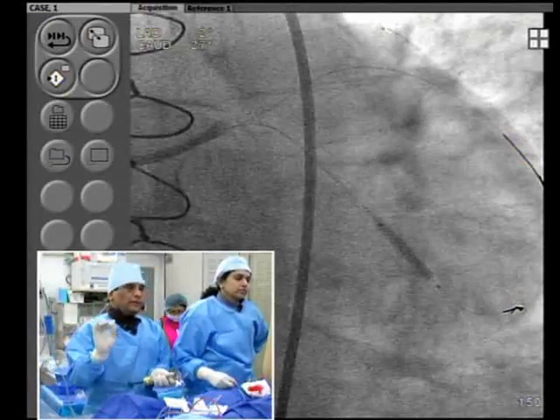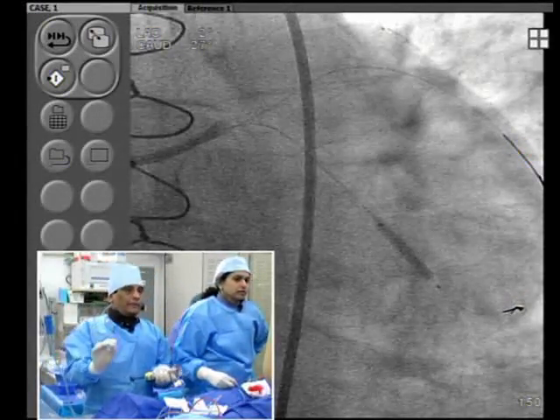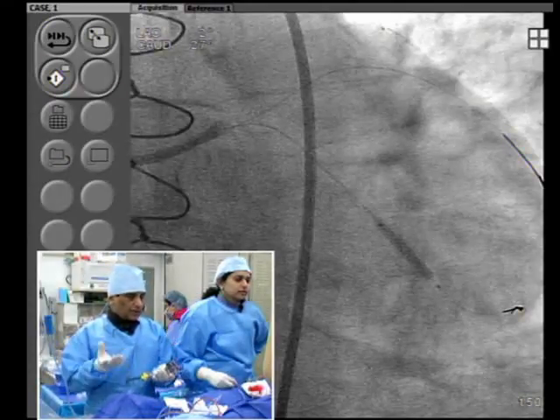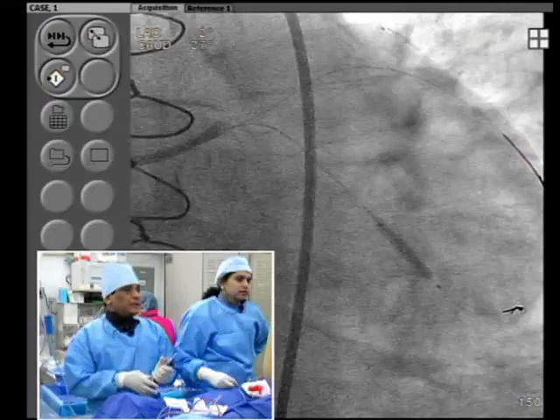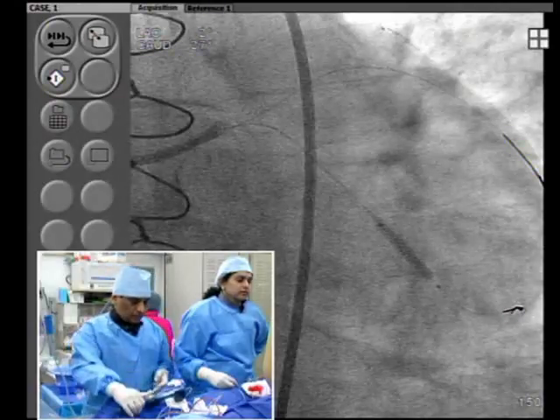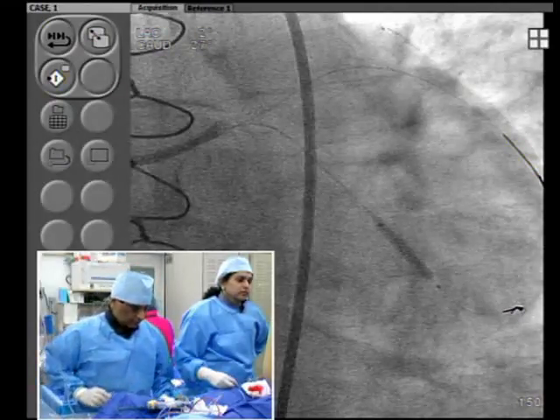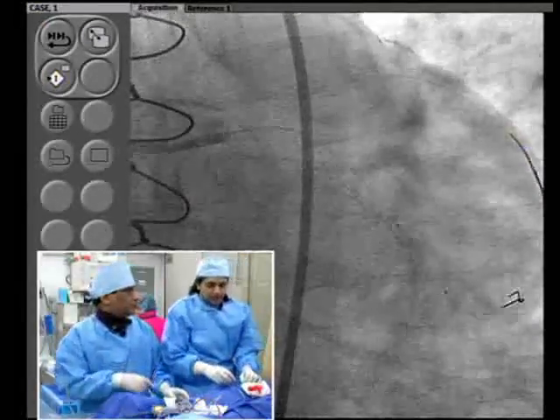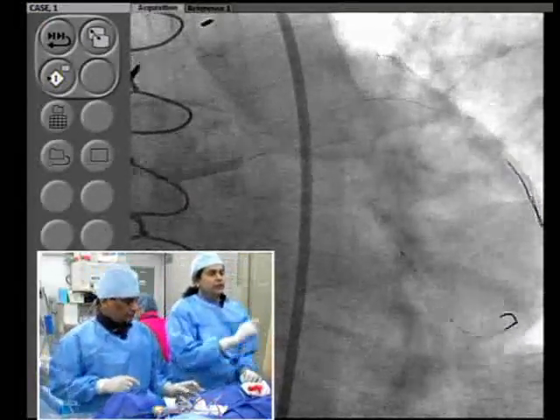Therefore, in a long lesion, I usually advance the balloon a few millimeters distal at 2 atmospheres. Very short inflation for a few seconds really makes it normal. You would not have anything against a strategy of giving a little nitroglycerin there and taking a look, though. Just another point of doing the procedure.